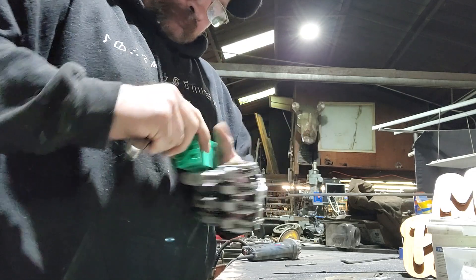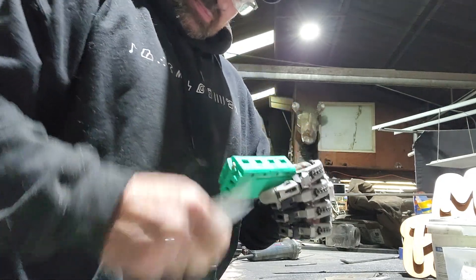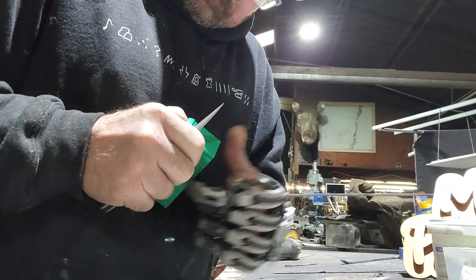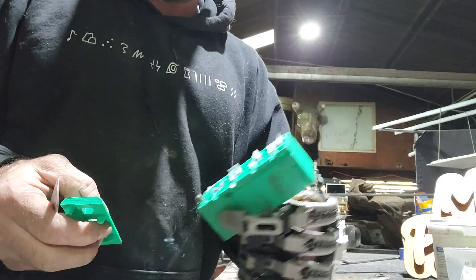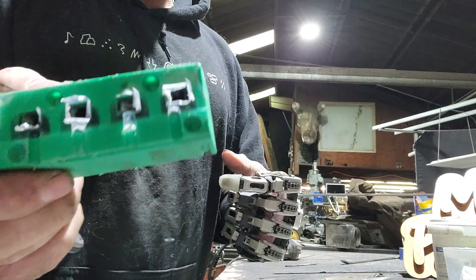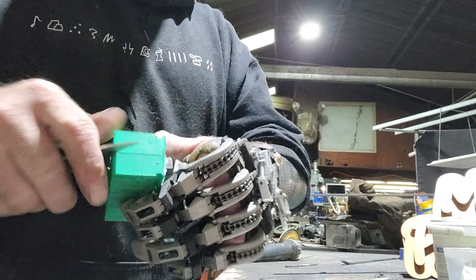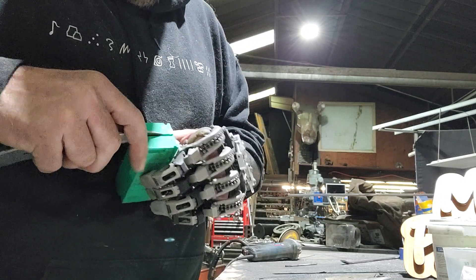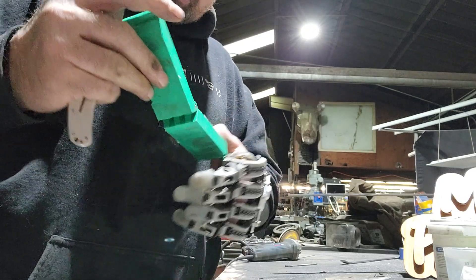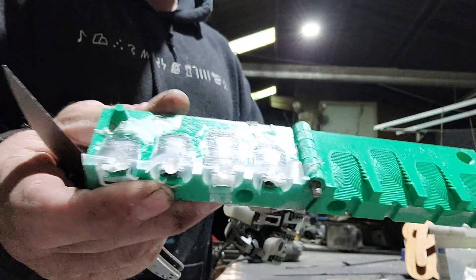Stick a knife in the corner right here and peel the cap off. This is when you get to see if too much leaked out or if you ended up being all right. These look pretty good — they're all right up to the top. There's a little notch in the bottom of the mold; stick a knife in there and slowly, gently pull. I don't use any release on the molds. Everything looks pretty good, got good coverage.